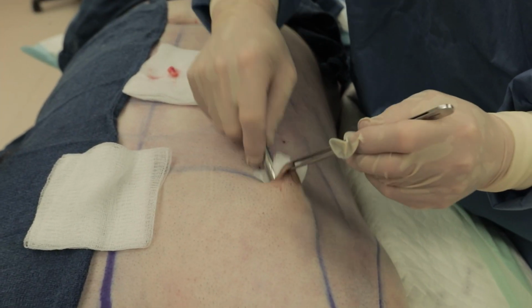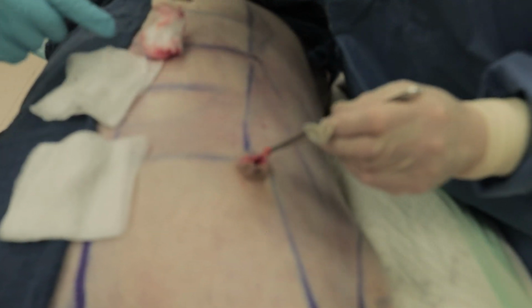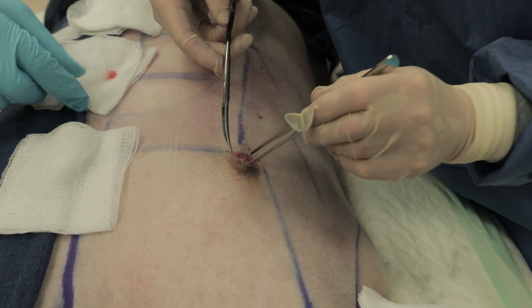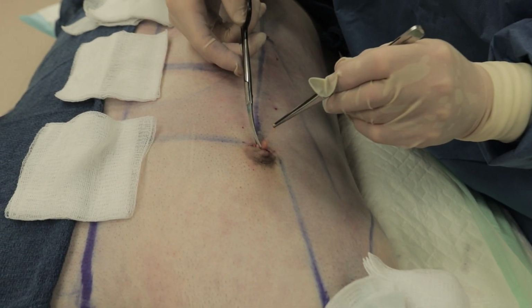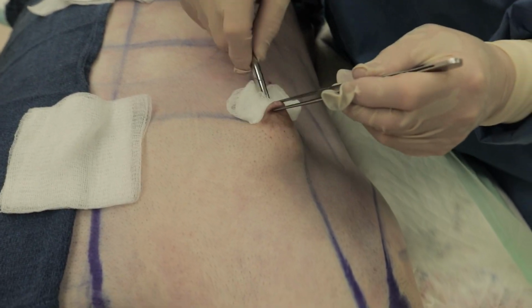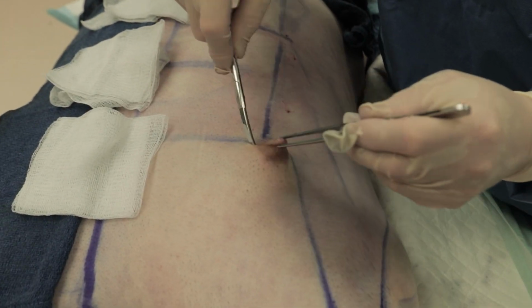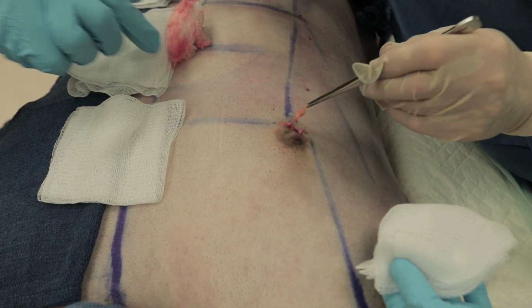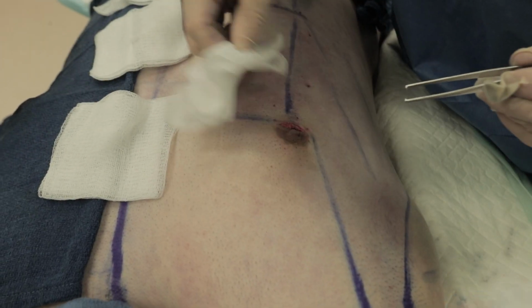Floaters that are going around in here. And a lipo underneath this again. Little floaters like that. Again, you put it in. Just wash it out. Pull it out, and the little attachments will come out. Perfect.